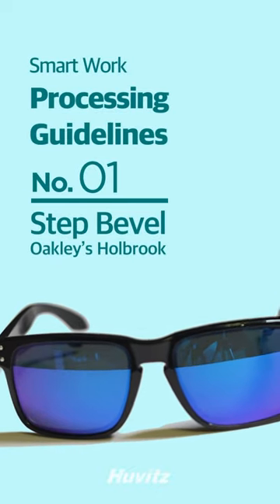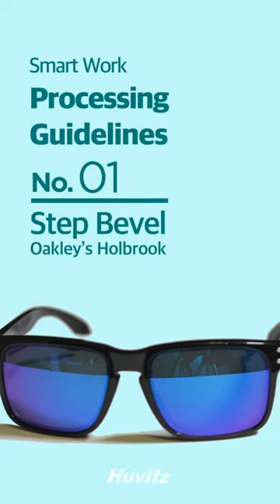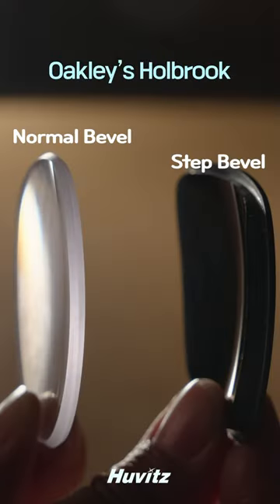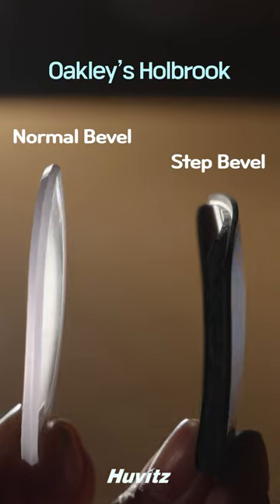Without taking into account the characteristics of the frames, they are all processed in the same way. Oakley's Holbrook frames require special processing because the front and back of the grooves where the spectacle lenses are fixed are at different heights.